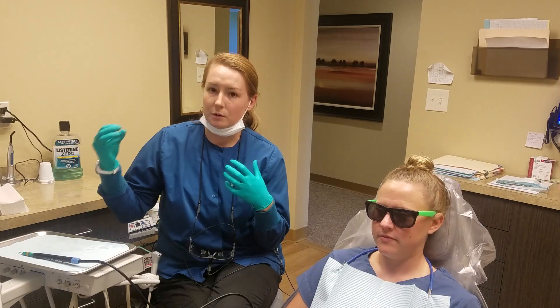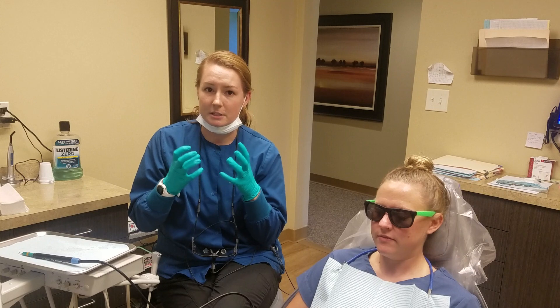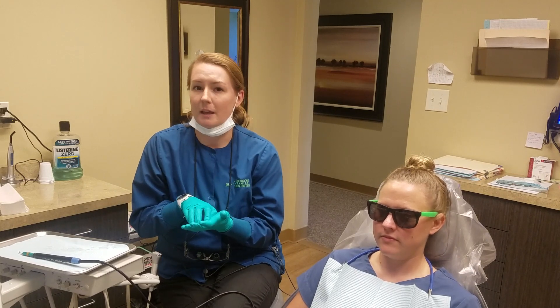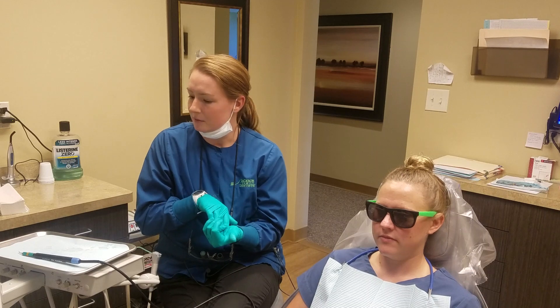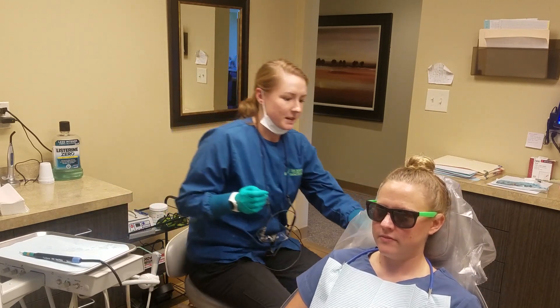This Cavitron goes through the mouth and flushes water into those pockets that your teeth are sitting in. It does a really good job — it breaks up any of the tartar in there and flushes out the plaque, so it just does a really good cleaning. I'm just gonna demonstrate it on Kelly here.